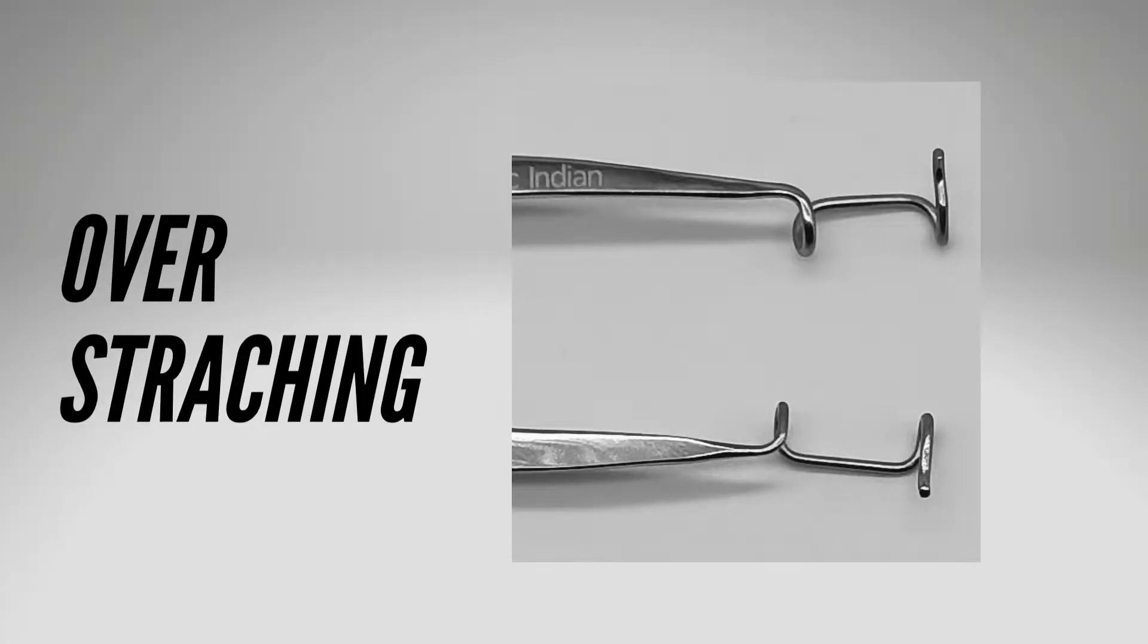It also has the disadvantage that it can create significant force on the eyelids which may increase the rate of post-operative ptosis or other eyelid malpositions.